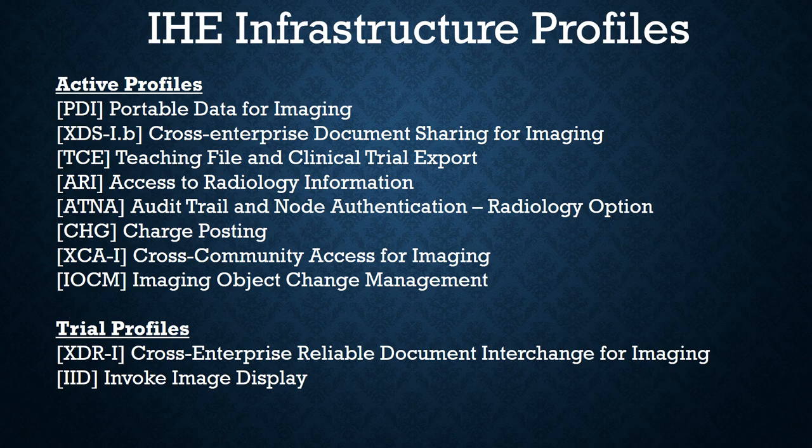The trial profiles are XDRI, Cross-Enterprise Reliable Document Interchange for Imaging, and IID, Invoke Image Display. And I want to talk about X for a minute. X. Anytime something is cross something, if it's cross-community, cross-enterprise, I always put an X on it. So anytime you see X, you know it's cross-enterprise.